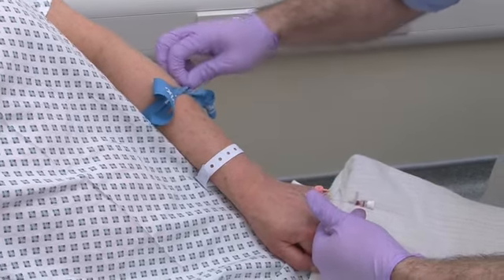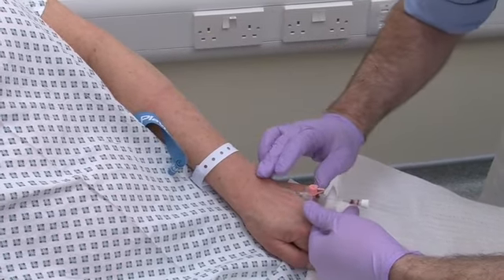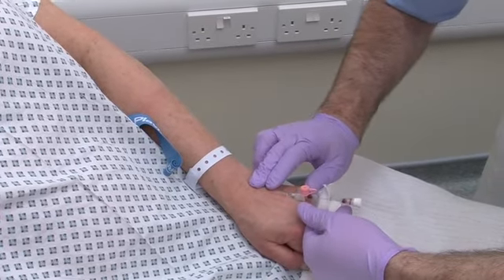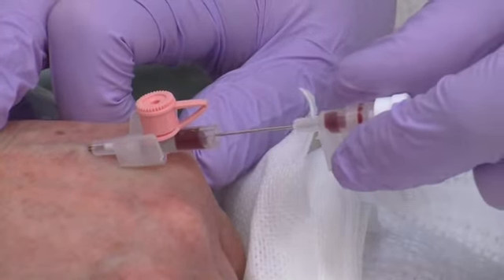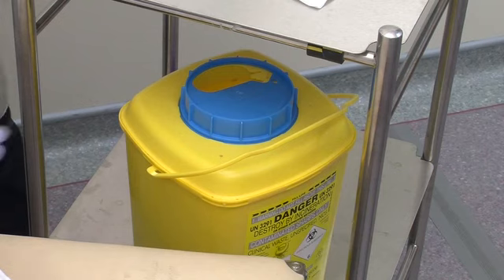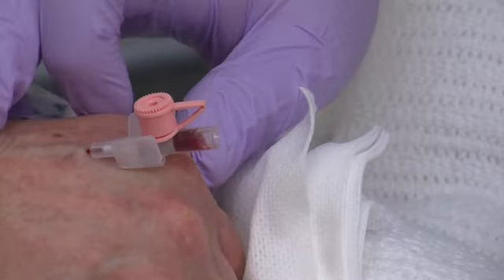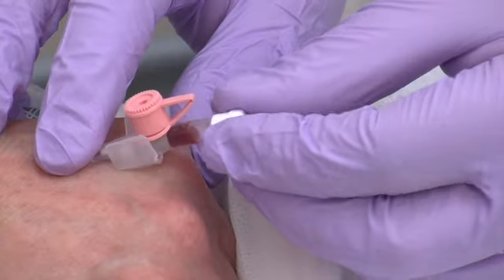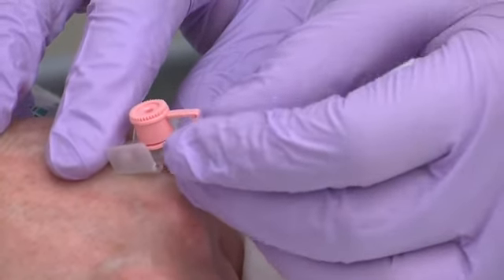Remove the tourniquet from the patient's arm. Remove the needle and dispose of it safely in the sharps bin. Connect an appropriate cap or interlink system to the end of the cannula.